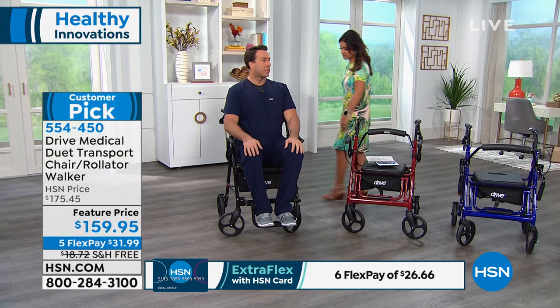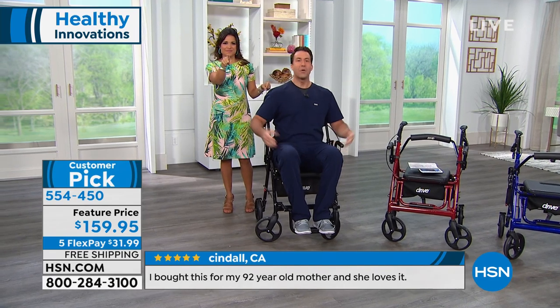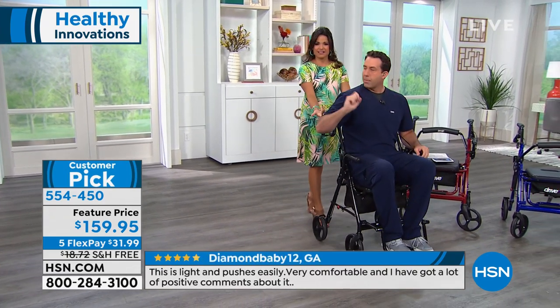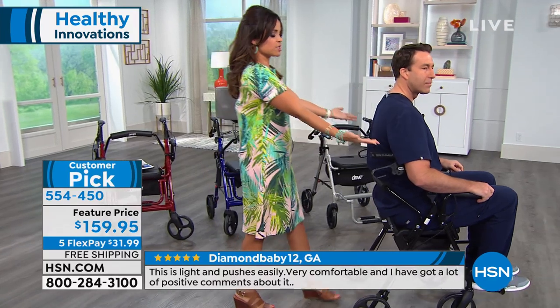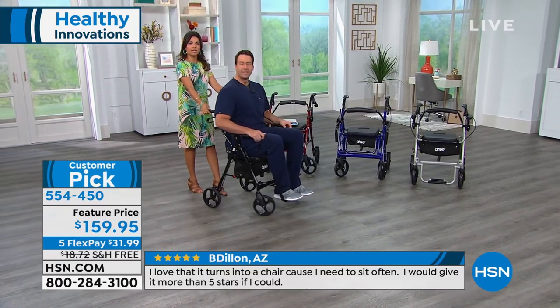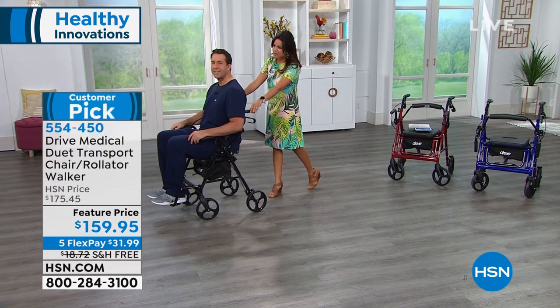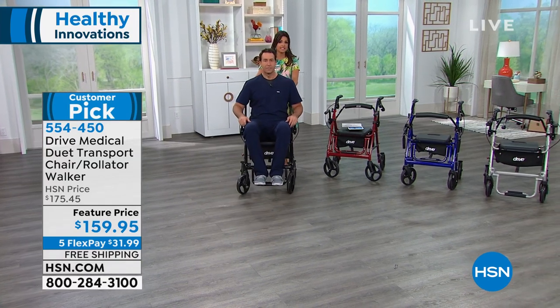I'm going to unlock the brakes. 230 pounds — I'm 6'3". Now talk about how easy it is to push me: I'm 5'2" in high heels just using two fingers to illustrate the ease of use. That's the kind of thing that makes or breaks the idea of going out and being with family, joining people at events, maybe going somewhere crowded or a restaurant, being able to get through very easily, then fold it up when it's not in use. This is why it's become such a huge customer pick — the ease of use, the freedom, the confidence. With over 200 gone already, the burgundy has about 50 left total.